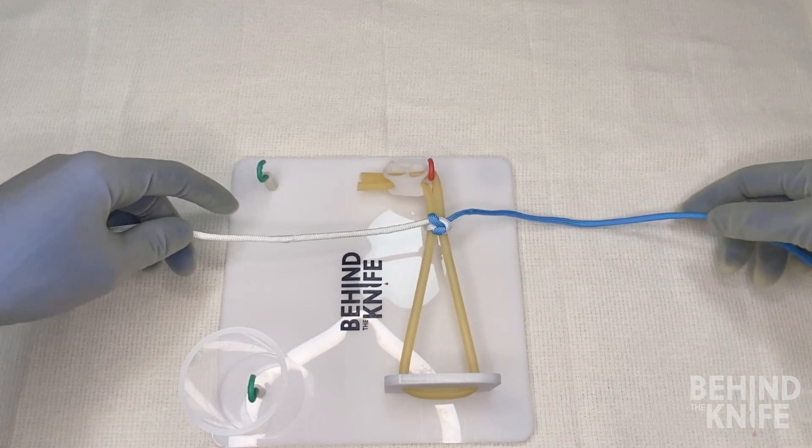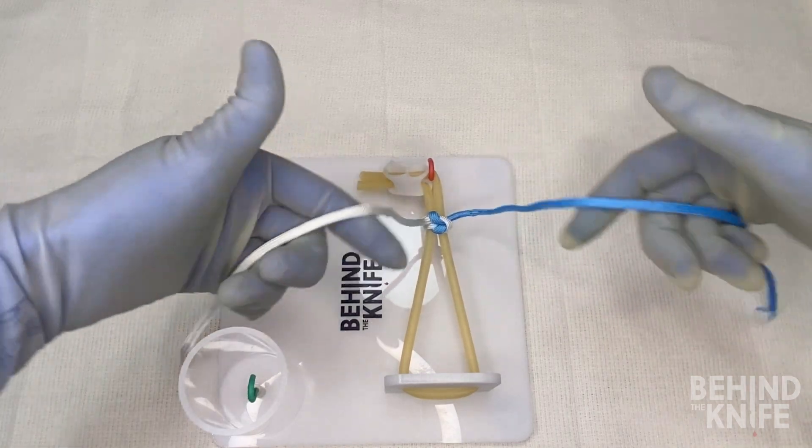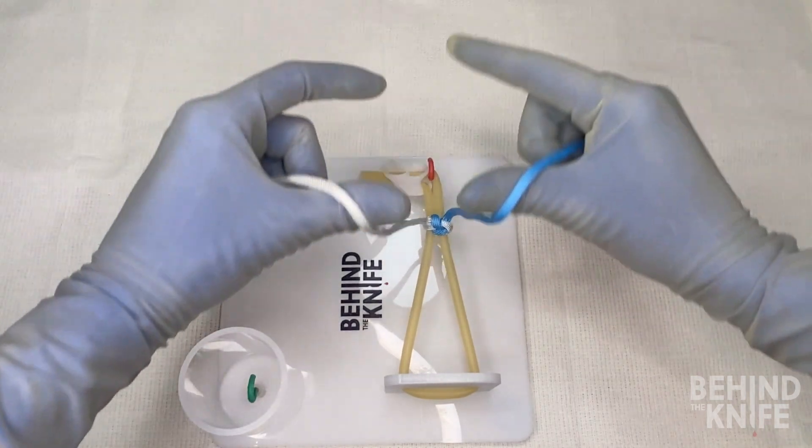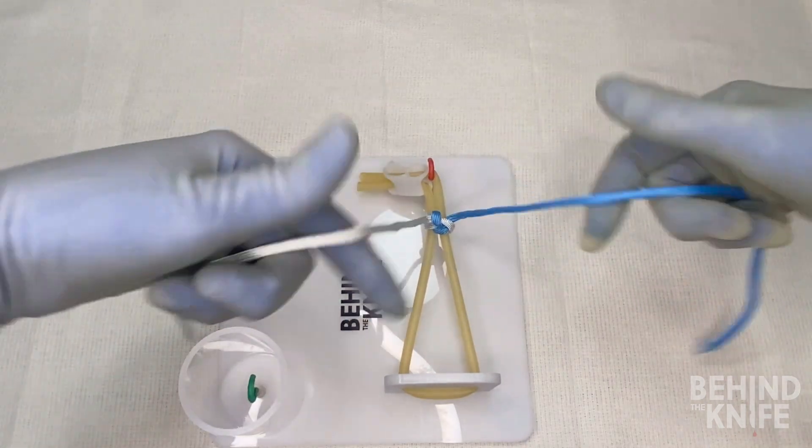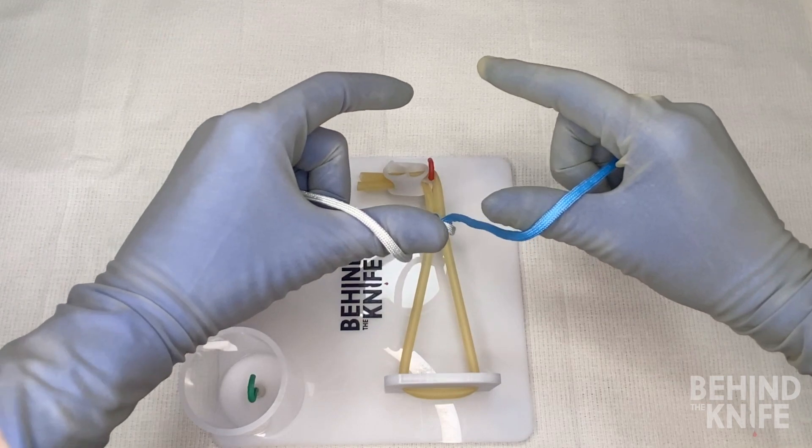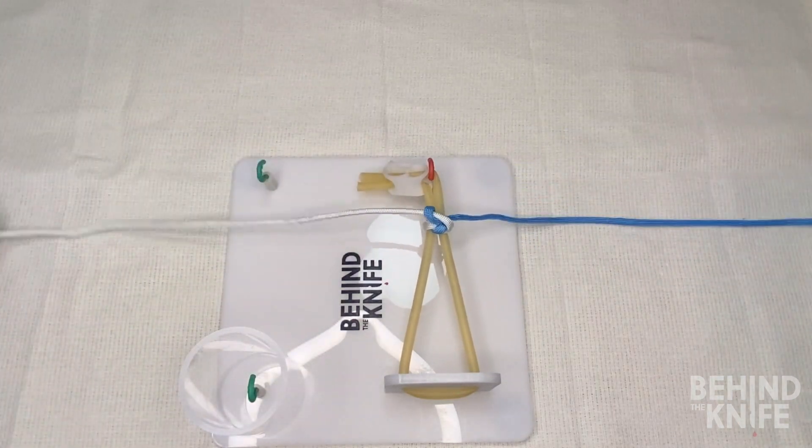To continue this, you'll go back to throwing your next knot using your L's, followed by the C's, alternating back and forth, so that way each time you're laying a nice square knot. And that is how you do a left-handed, two-hand tie.